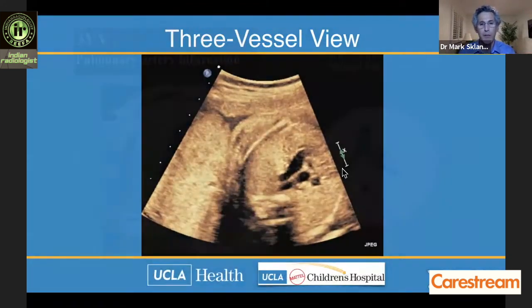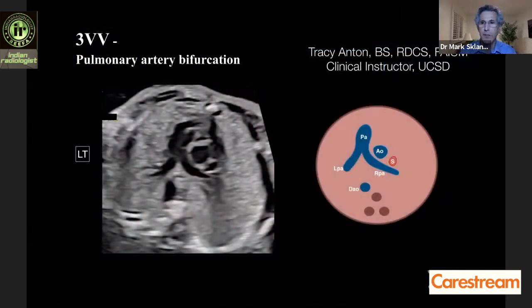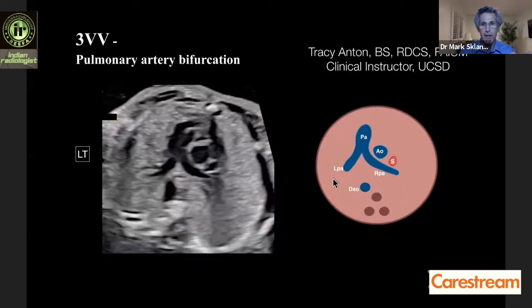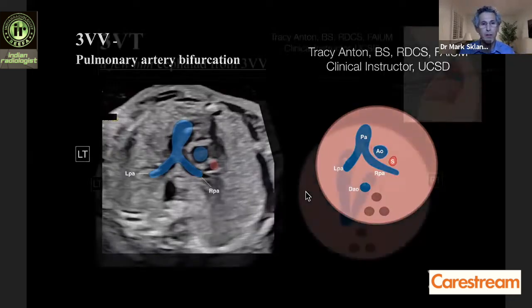These are some nice images borrowed from Tracy Anton, a clinical instructor at UC San Diego, showing basics of the three vessel view: the pulmonary artery bifurcation, the LPA and RPA, the aorta, and the superior vena cava. This view is sometimes one of the best for looking at the branch pulmonary arteries themselves.